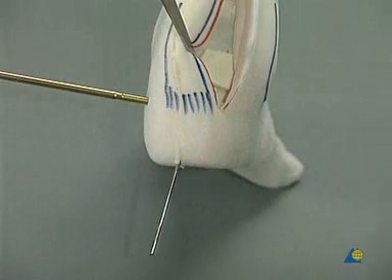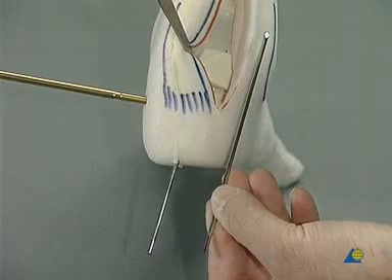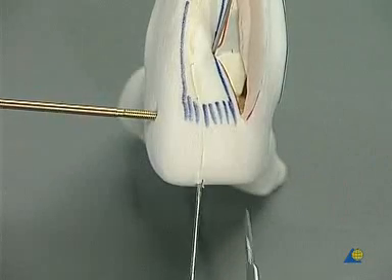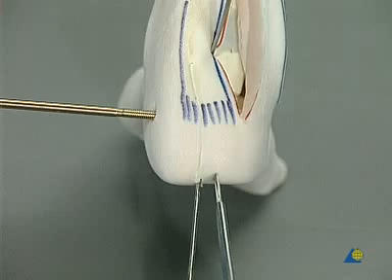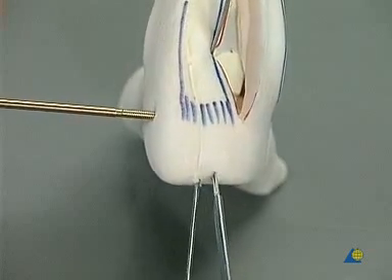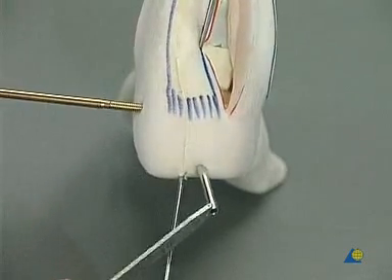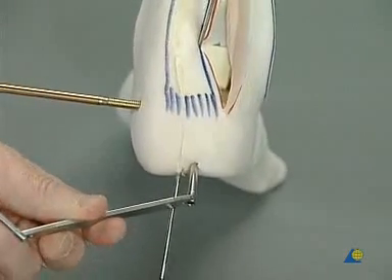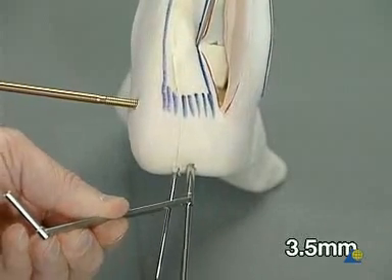A second K-wire is used to check that the first one does not cross the ankle joint. A stab incision is made in the heel, and the drill guide is inserted through it. Using a long 3.5 mm drill, a hole is drilled from the calcaneus to the talar dome through the bone block.